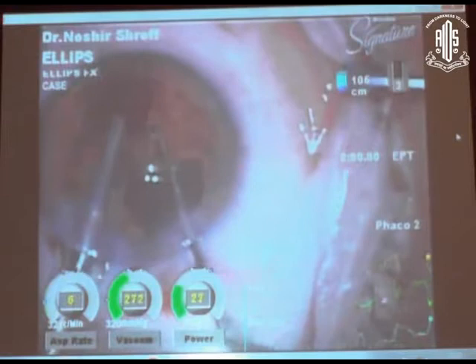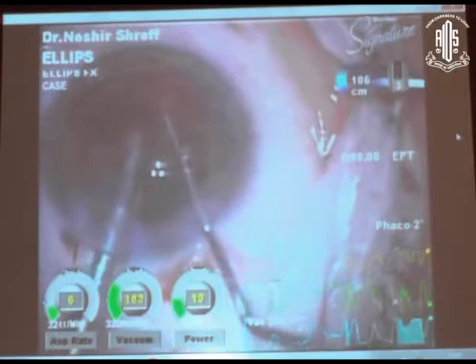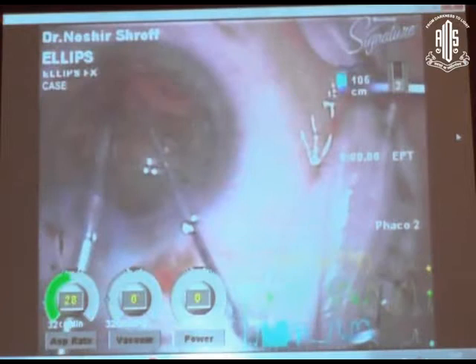You will see the last fragment, the last pieces of nucleus, being emulsified. And whenever the vacuum breaks, when the epinucleus is bare, there is hardly any surge. So this surge is controlled by two methods, the CASE vacuum and the occlusion mode phaco.